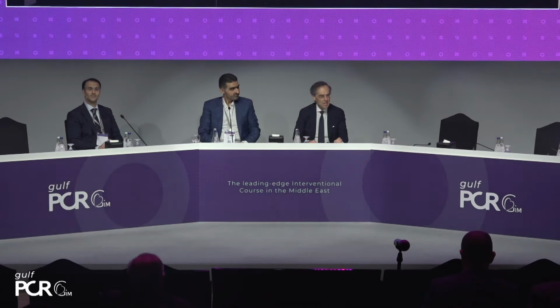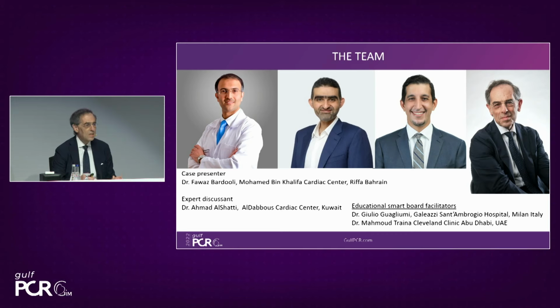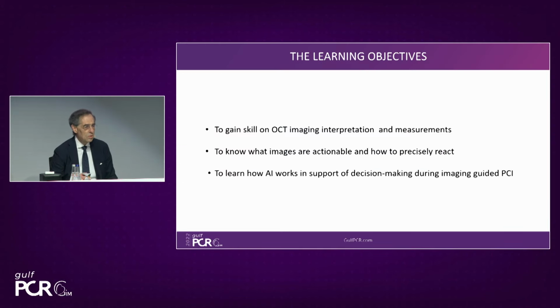Hello, everybody, and a very warm welcome to this case-in-point presentation focused on decision-making in complex PCI, how we can get by using imaging and especially by using OCT plus artificial intelligence. Here you can see behind me the team we are going to work with. And we are going to have different types of objectives today.